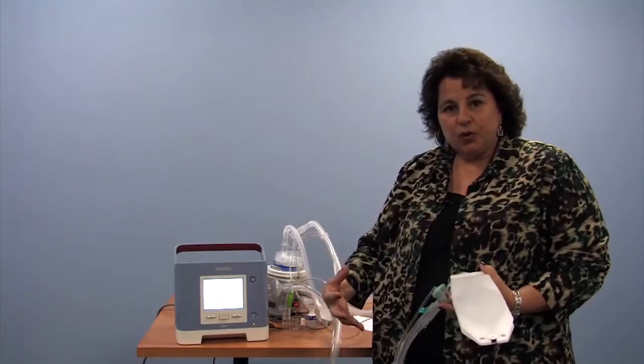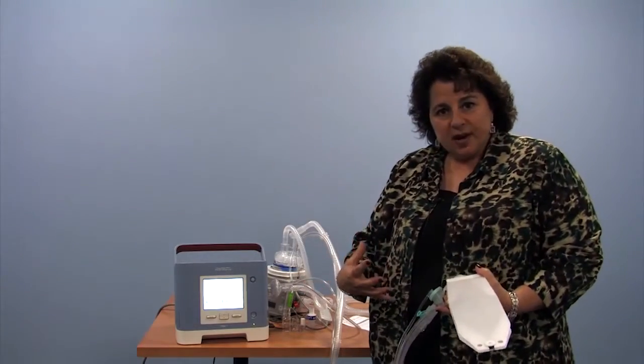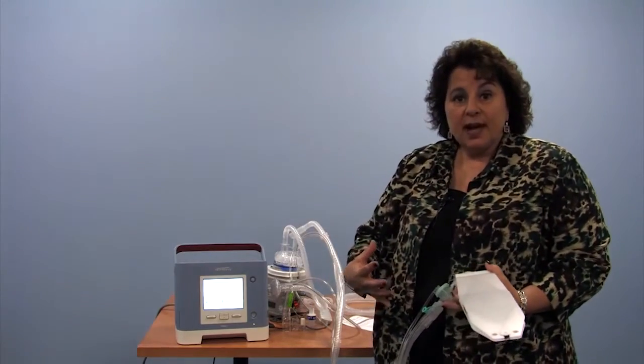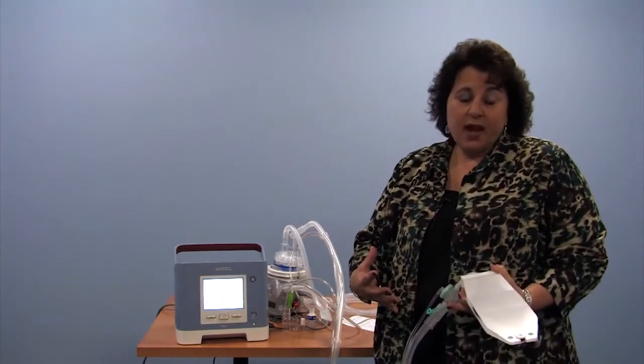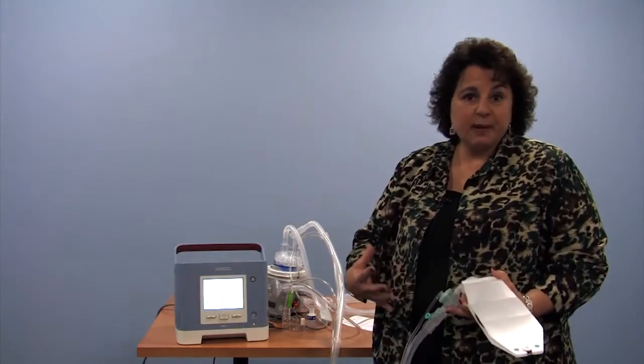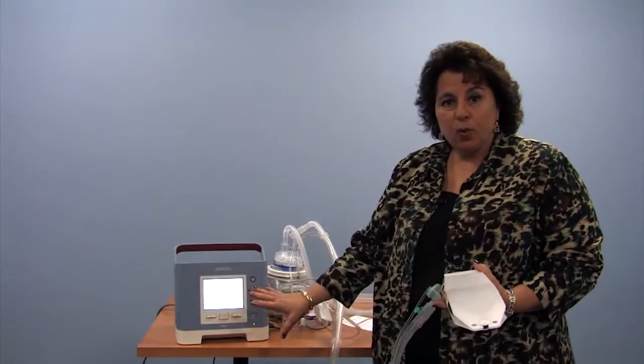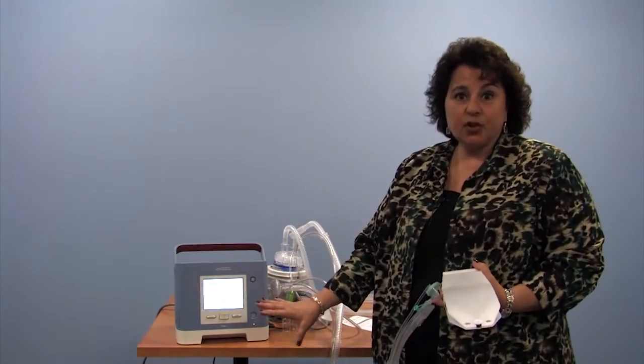These are just numbers for you to know what they are so that we know if they're different when something changes. And also for those helping care for the child, whether it be family members or nursing staff, to know what is normal awake and what is normal asleep for your child.